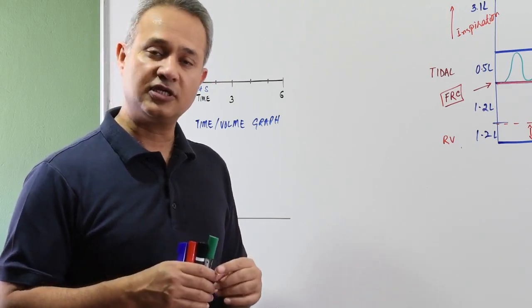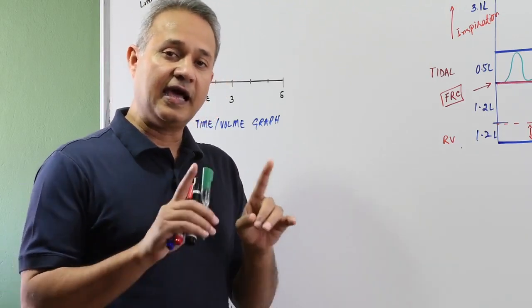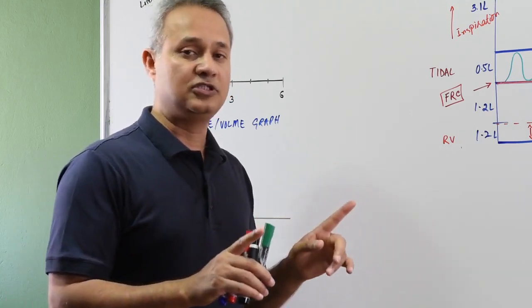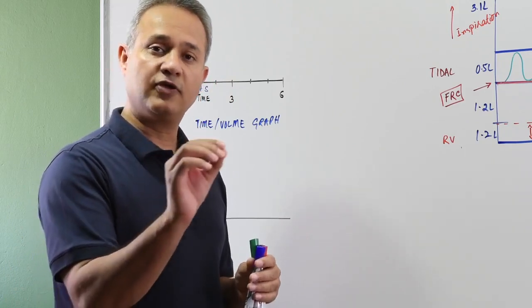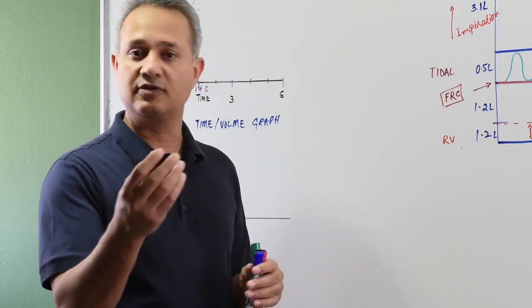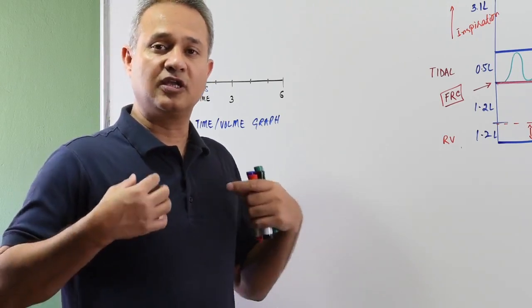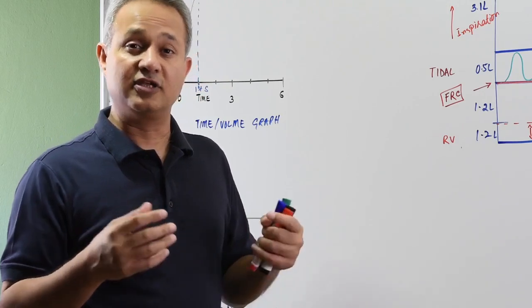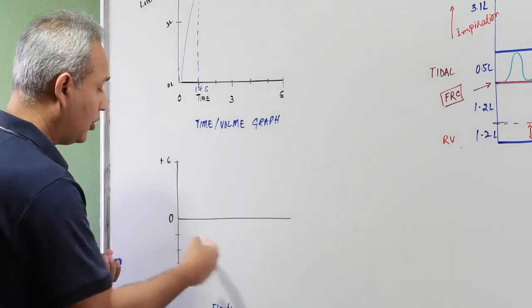And why is that interesting? It is interesting because in various diseases, at various volumes, flow becomes changed, and detecting that change allows you to figure out if it is a restrictive disease, for example, or obstructive disease, or if there is an obstruction outside of the lung in the airway, if there is a tumor in the trachea and so on.